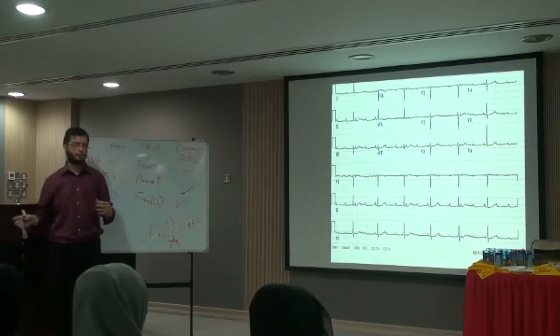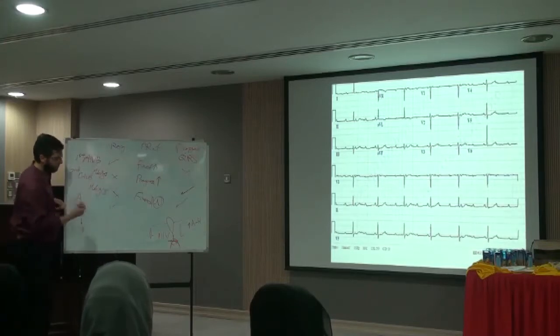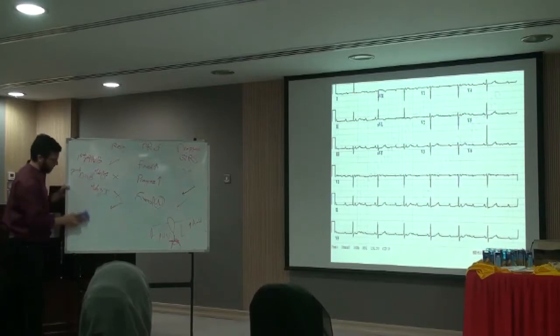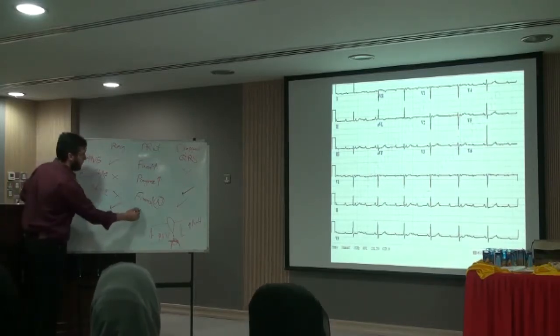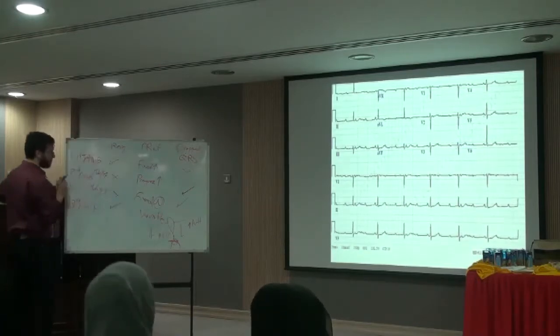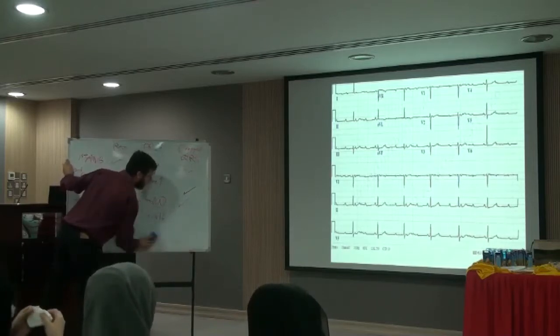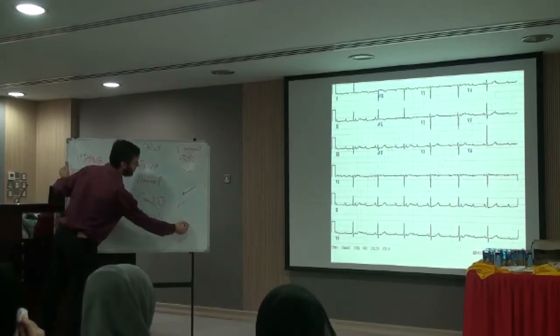Anyways, now if you look at this table. So here we write variable. And here we write there is no drop.